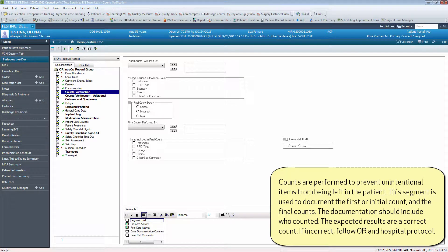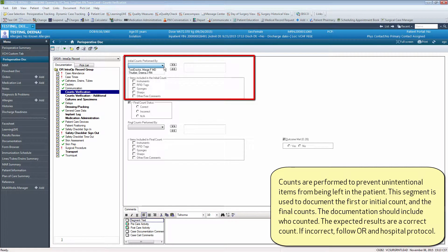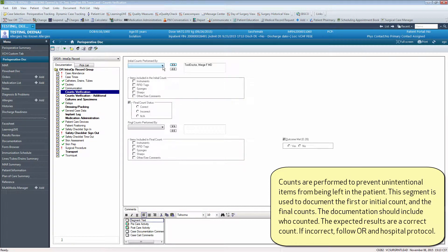Counts are performed to prevent unintentional items from being left in the patient. This segment is used to document the first or initial count and the final counts.